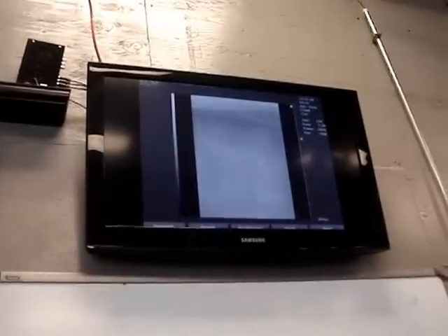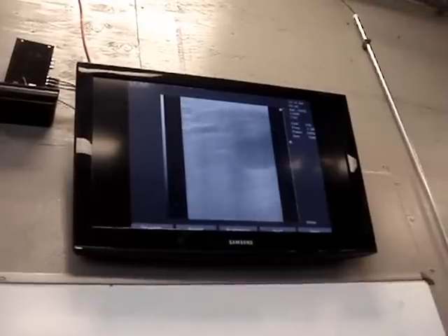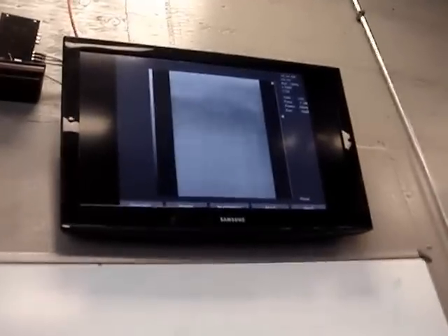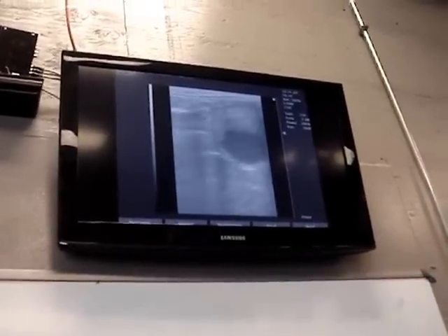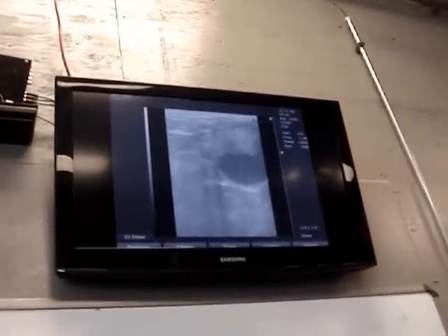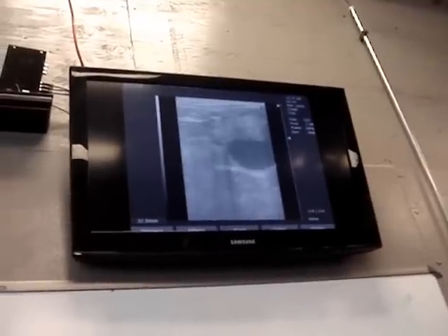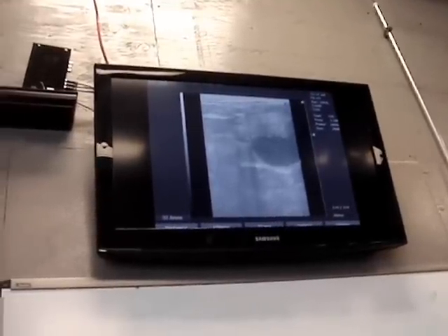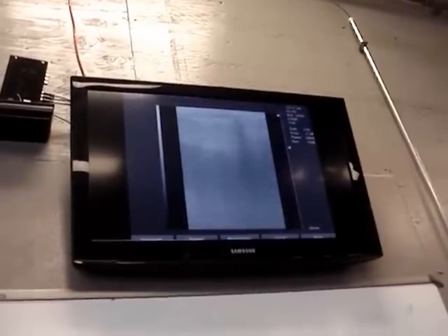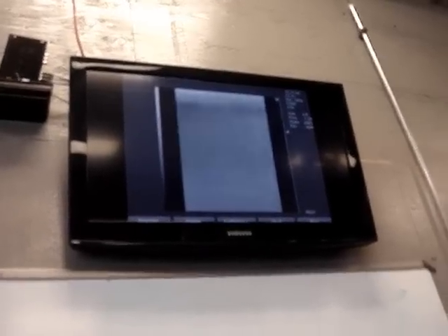So, cruising on down here, we'll see if I can get a better picture. Her right ovary was actually stuck behind a piece of her colon. So she's in heat, and this is her big follicle right here. That's the follicle that's going to be the dominant follicle that's going to ovulate soon. And it's the one that's producing all the estrogen that makes her show that behavioral sign of estrus to the stallion.